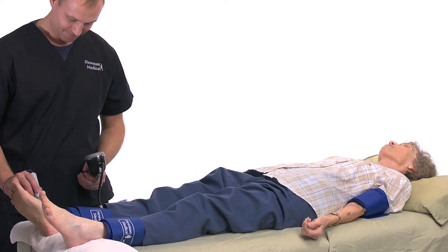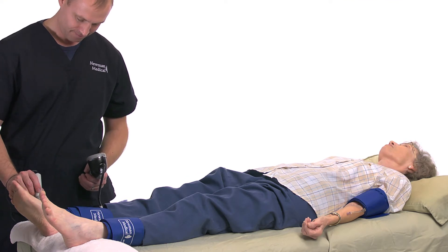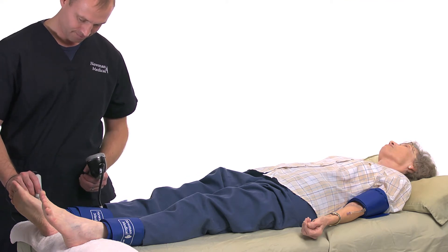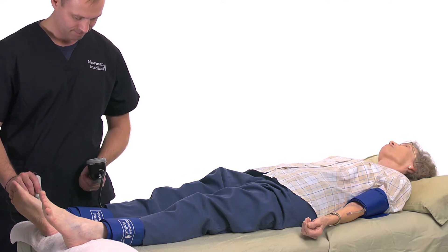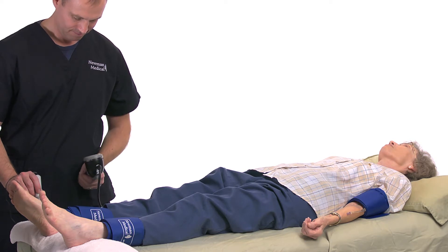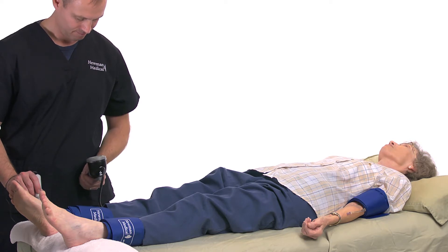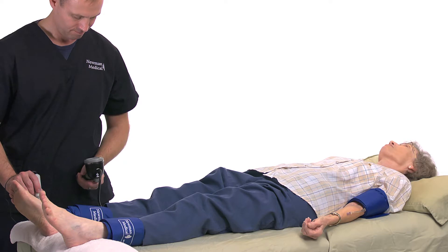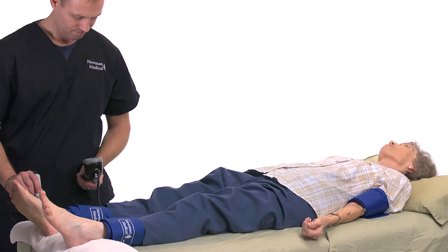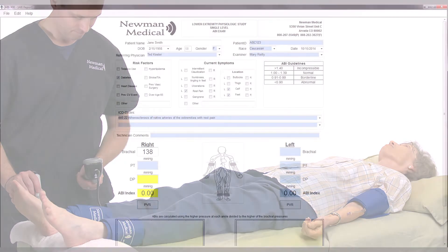Release the pressure in the cuff and move the aneroid to the ankle cuff. At the dorsalis pedis, DP, field, take an ankle pressure using the Doppler probe on the DP artery on top of the foot. When blood flow returns, note the pressure and enter in the DP field.